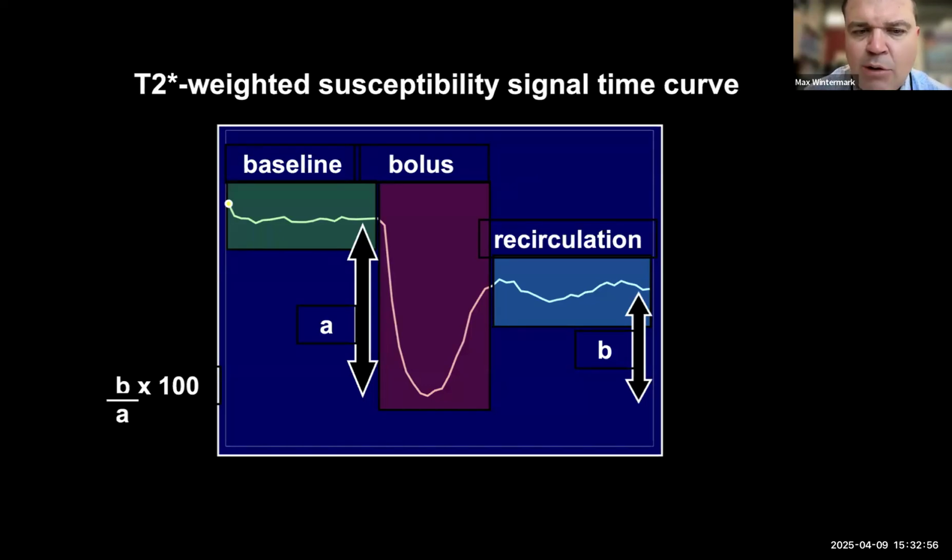So DSC is illustrated here. For DSC, basically, you inject a relatively short bolus of gadolinium contrast. You're all familiar, when you inject contrast, you look at the post-contrast T1 weighted images, and you see some brightness where the tumor enhances. So that's one effect of the contrast agent, to increase the signal on the T1 weighted images.